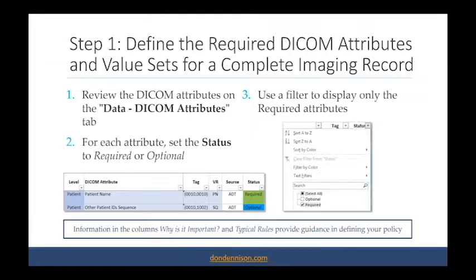Is it the EMR, so it's coming through an ADT message? Is it being mapped in from order information, possibly populated through a DICOM modality worklist? Is this something that the DICOM modality workstation itself is entering, the tech?